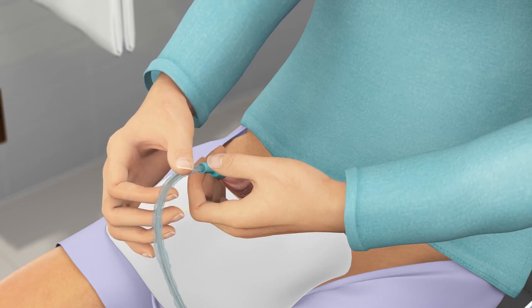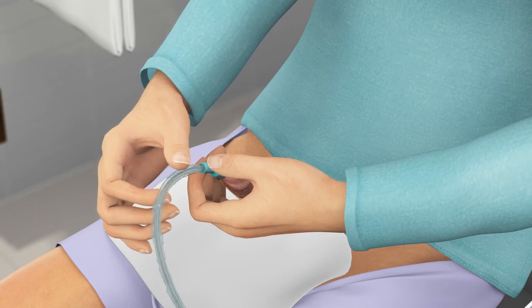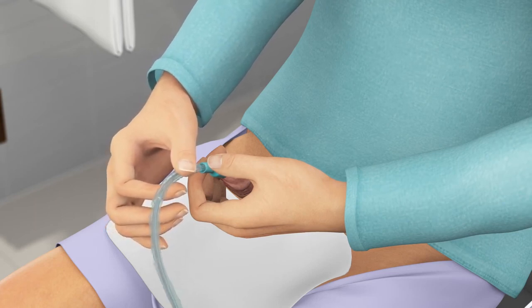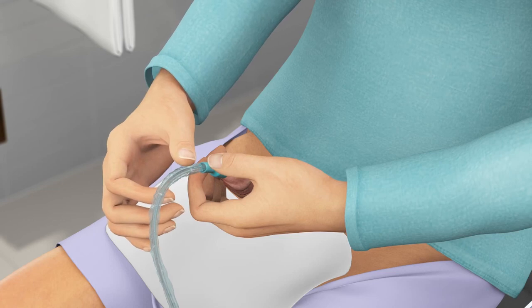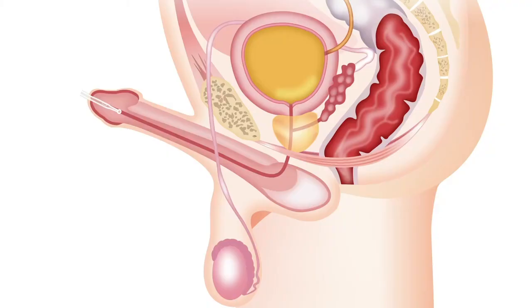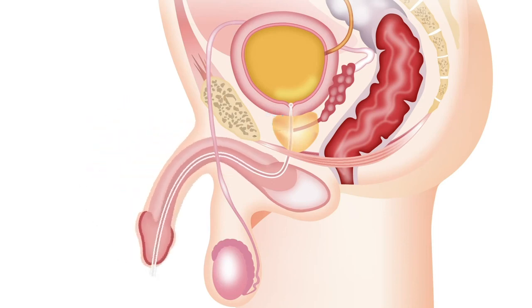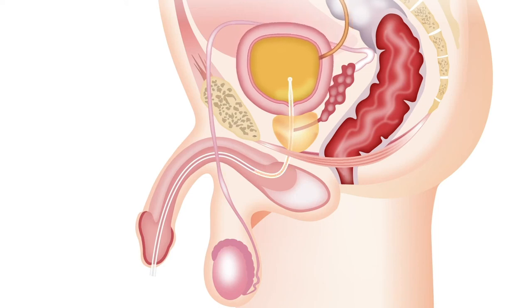With your dominant hand, start inserting the catheter by pulling the sleeve towards the penis head. As the catheter is protected from contamination by the dry sleeve, you can take hold of the catheter at any point. Insertion is easiest if you take hold of the sleeve quite close to the penis head. Slowly and gently insert the catheter into your urethra. It is normal that you feel resistance from the sphincters and sometimes also from the prostate, so be gentle. Continue to insert the catheter until it reaches your bladder and the urine starts to flow.